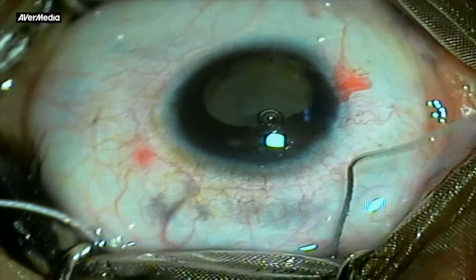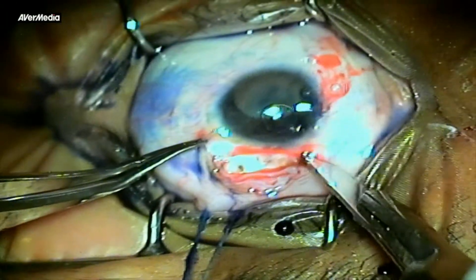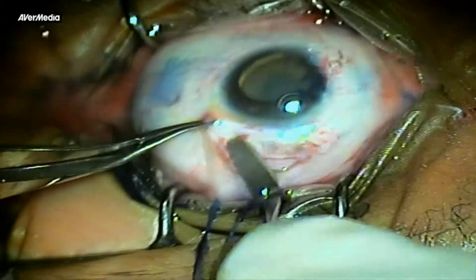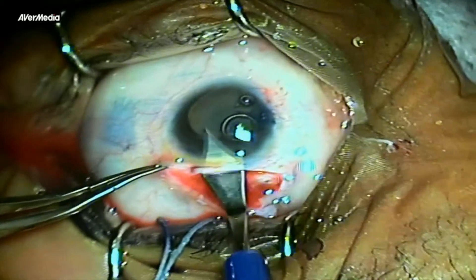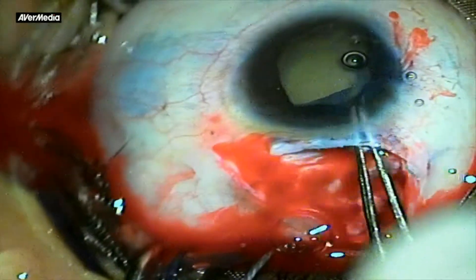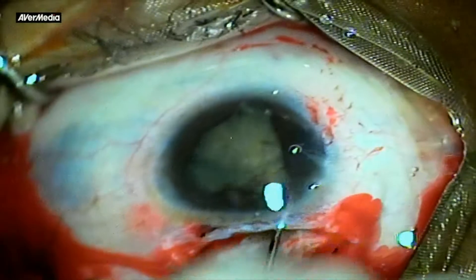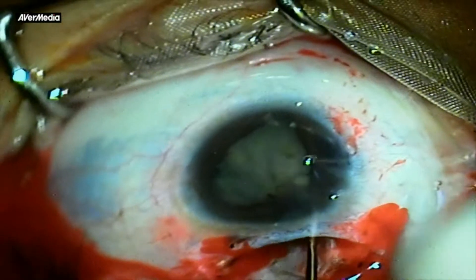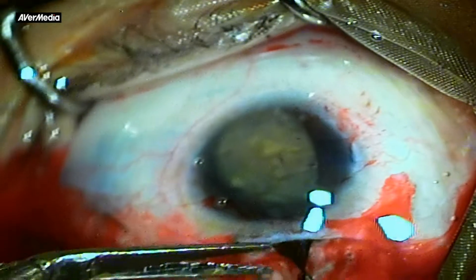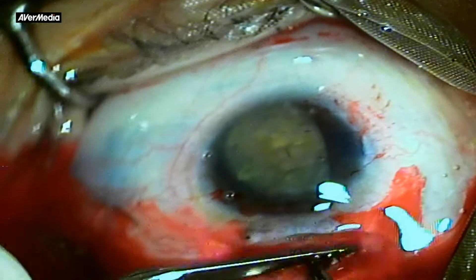Another case was the fellow eye of the same patient. Corneal as well as pupillary size were a tad smaller than the previous eye. Adhering to the same principles, a larger scleral section was made and wider tunnel dissection was achieved. A continuous capsulorhexis was ensured and hydrodissection was done. At this point, the superior iris started prolapsing out of the section and the pupil became smaller. Ultimately, a small sphincterotomy was undertaken and the pupil was enlarged to allow the nucleus to pass through.